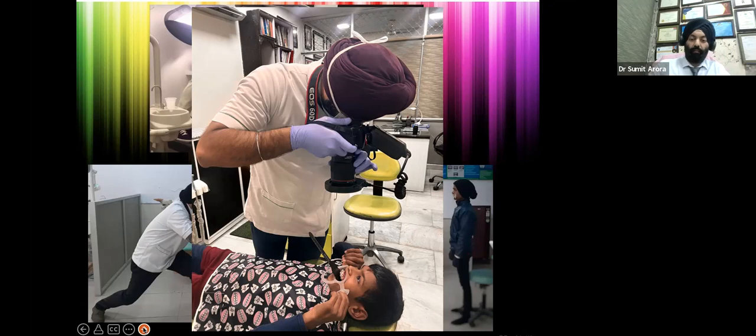If you are saying, sir, I don't have an assistant at all, how will I click? No assistant required. Believe me, either extraoral photography or intraoral photography. If you train them, that's fine, that will help you. But if you don't have an assistant, there's no need to worry. You can even then click good photographs.